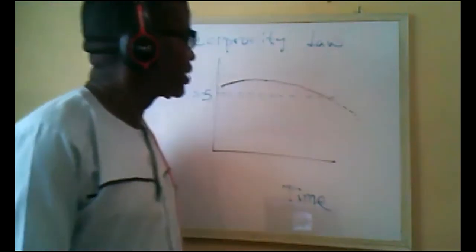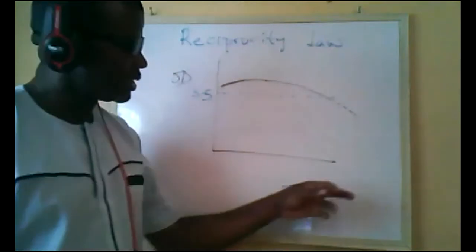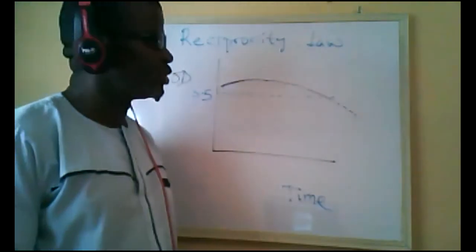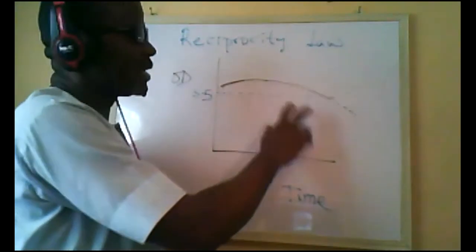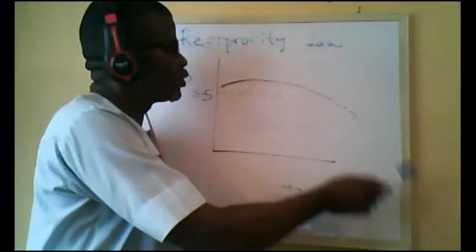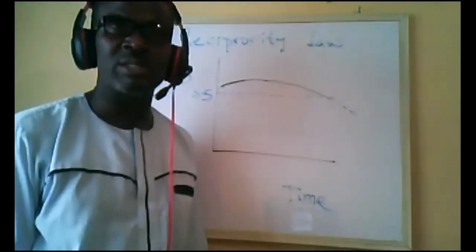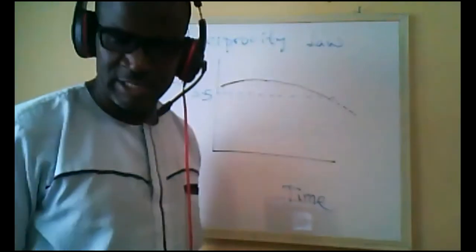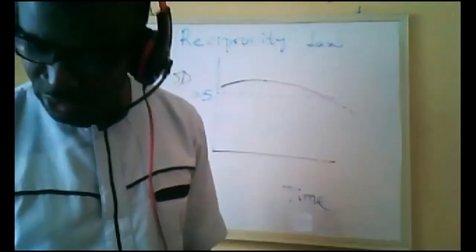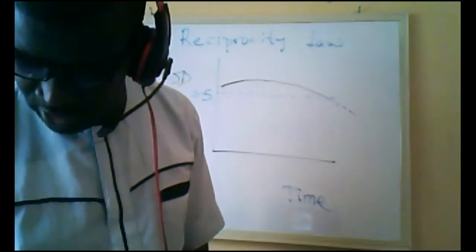So you can see, no matter the time we have used for the exposure, we should have the same optical density. At times it can be slightly higher or slightly lower, but when it goes beyond a particular range, it can have the reciprocity law failure. And I said it is an issue when we come to mammography. I think let's see the range.